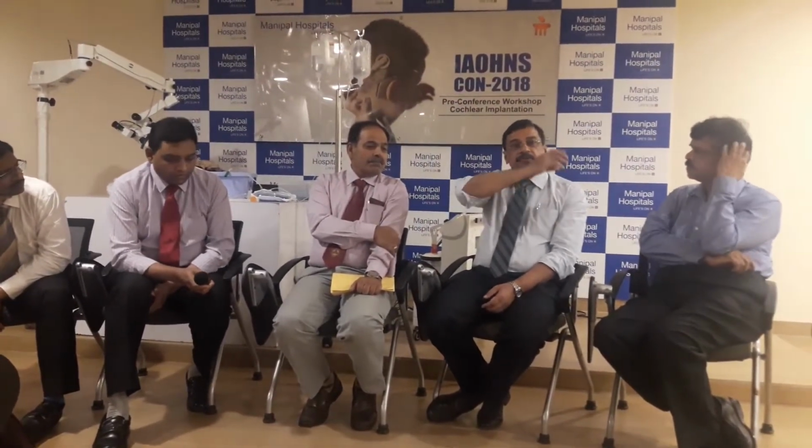Not actually glue ear, the drum was a little retracted, and I felt that this is going to give rise to trouble, so I put a grommet in. See, remember, all this trouble is only for about a month or a month and a half. If you can skip the first month or two and run smoothly, then there's no problem. Because two months later, when you go in, you have a beautiful capsule all around the implant, right up to the cochlea, from the receiver stimulator onwards, a nice fibrous capsule isolating it from the middle ear.